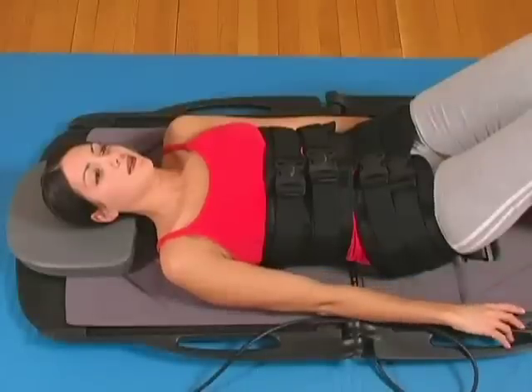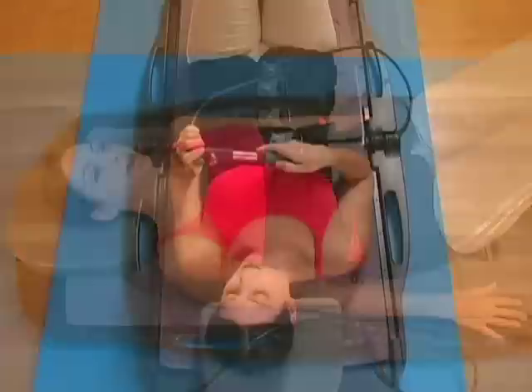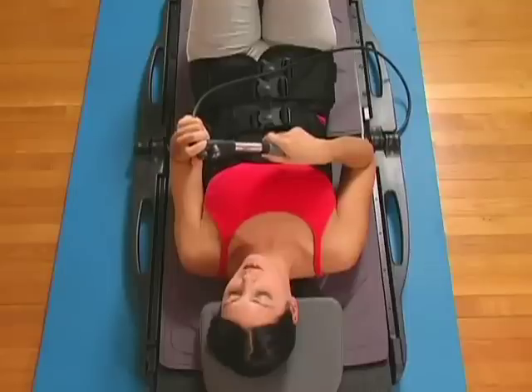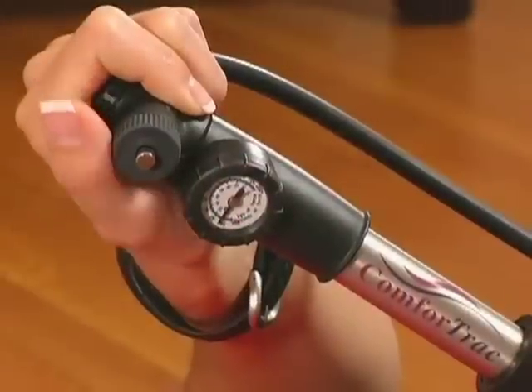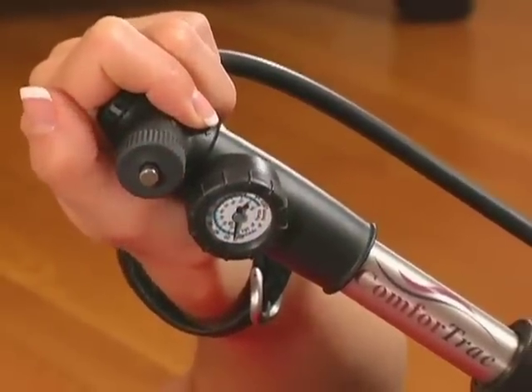If the traction force reading drops, it was probably caused by repositioning. To rectify, slowly pump the air cylinder back to the desired reading then relax. If you pump the air cylinder beyond your recommended traction force, press the release button immediately until the correct traction force has been attained.